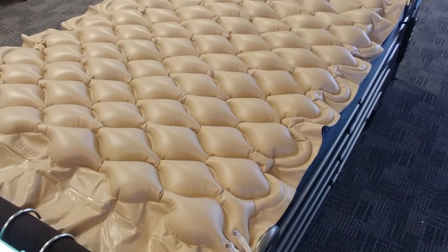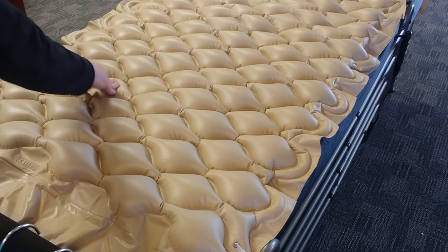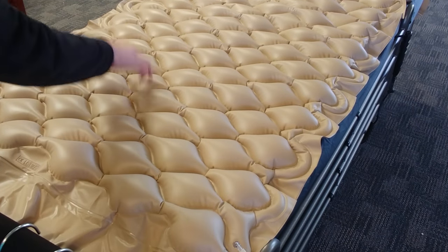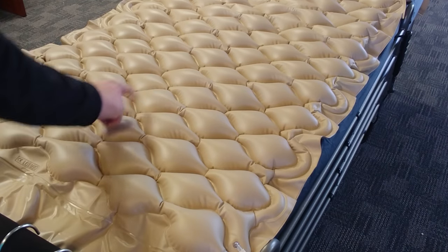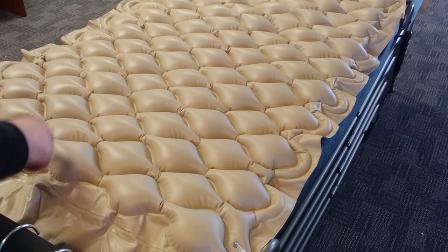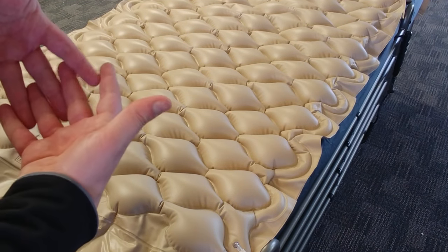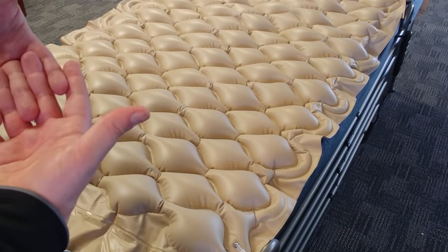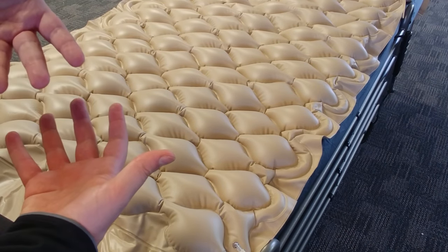Right now you can see most of the cells are inflating — it's actually in between cycles. What will happen is every few minutes these chambers will alternate their pressures. There are basically two interlocking sets of air chambers, so one will inflate, one will deflate, and then every few minutes, vice versa.